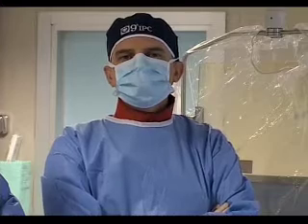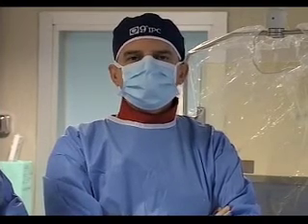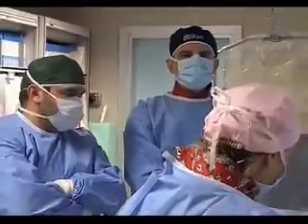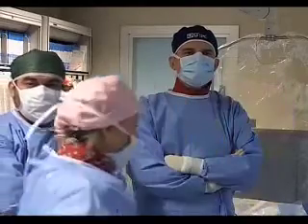Let's see, Elchanan is here. We have Elchanan Bruckheimer here, who probably has the world's largest experience with the Advanta V12. Elchanan, your comment about what you do in this patient? Microphone on, please.